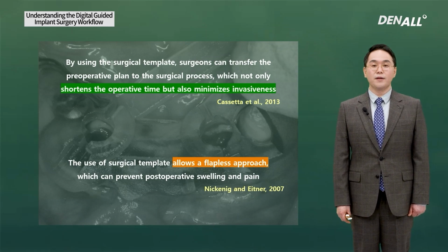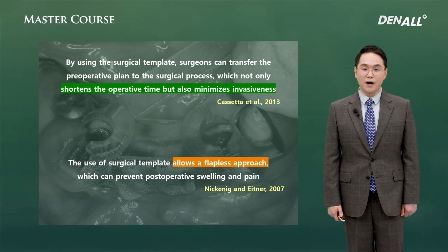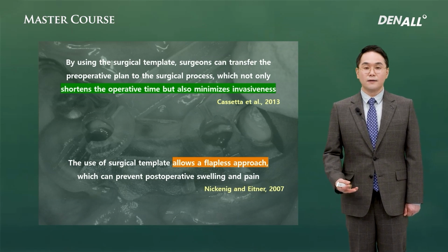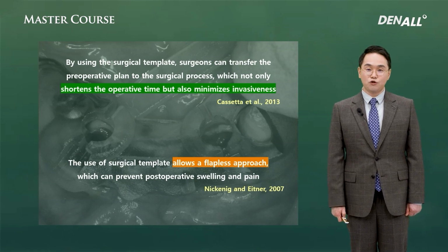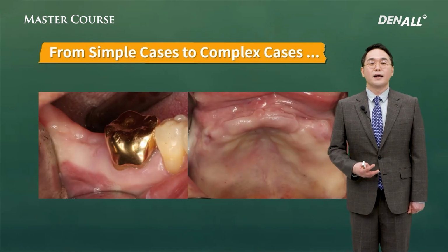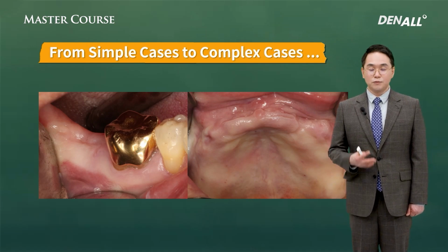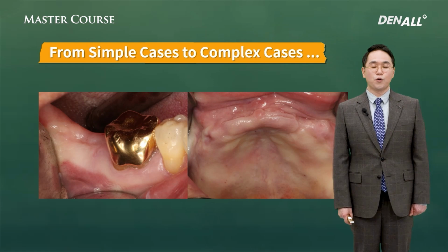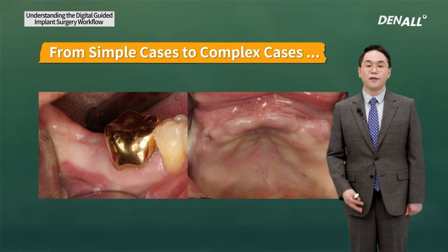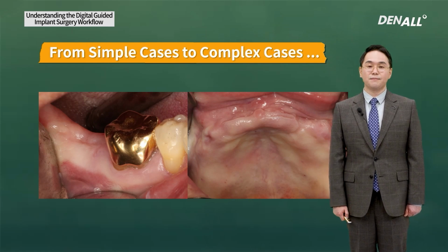Also, from the perspective of a patient, guided surgery allows a flapless approach, which can prevent post-operative swelling and pain, reducing the discomfort of a patient. So, guided implant surgery can be used from simple cases if you are a beginner to complex cases if you are a skilled doctor.